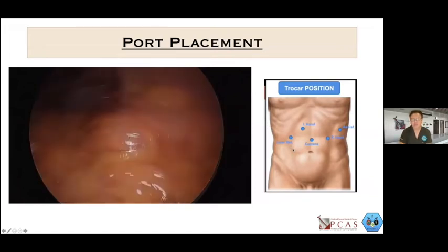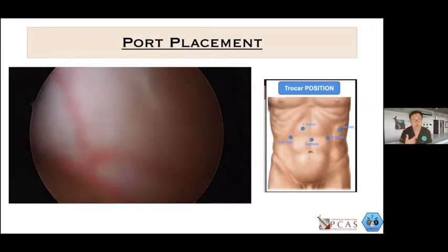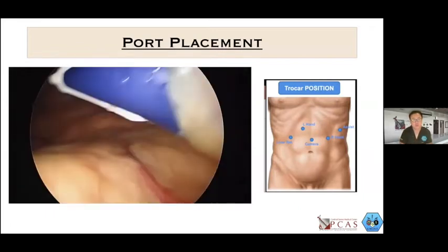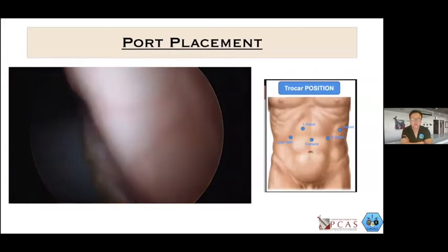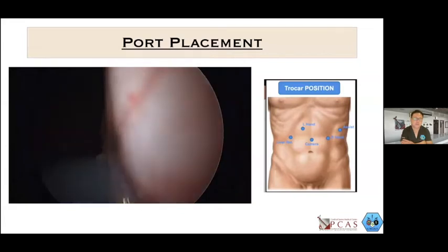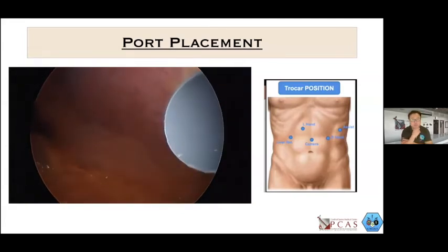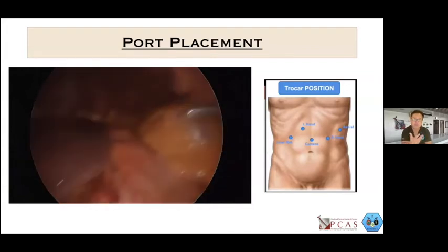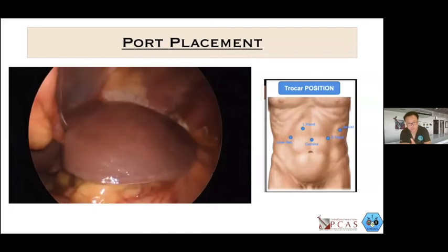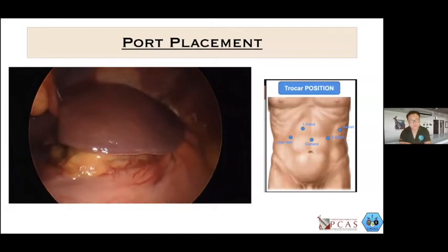Positioning is also a good idea on how you would want to set the stage for yourself. I'll show you later on how we would position our patient. I would usually put my patient in modified Lloyd Davis. Then, depending on the procedure, I would rather stand either in the middle of the legs of the patient or on the right side of the patient.